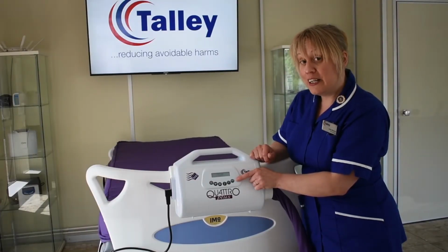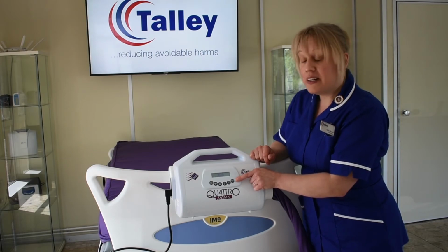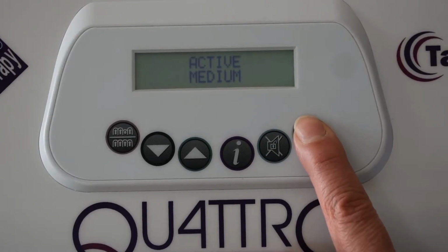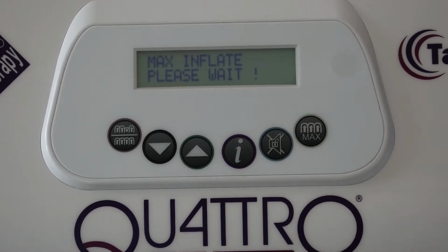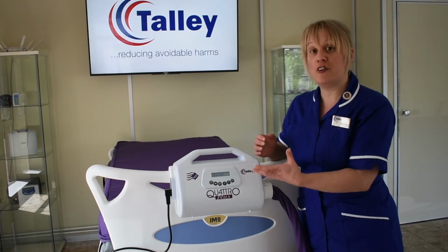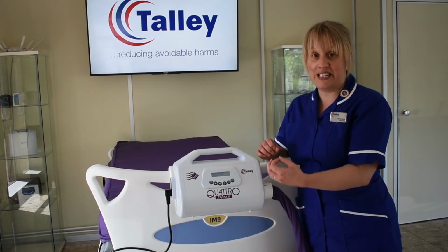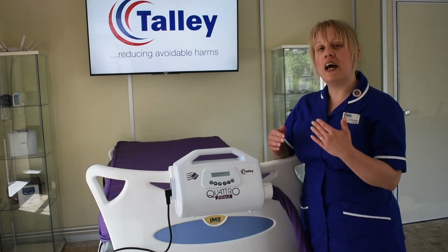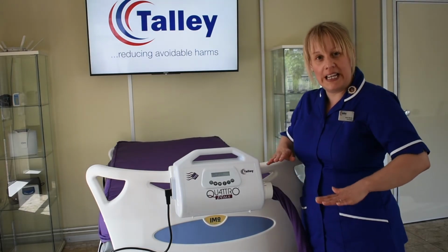And lastly, looking at the far right button, that button says max, and that stands for max inflate. So if we press that button once, the screen will read max inflate, please wait. And what the power unit is doing at this point is pushing as much air into that mattress as possible to create a really firm static surface. And that's the sort of surface you may use to help your patient in and out of bed safely, to support them getting in and out.